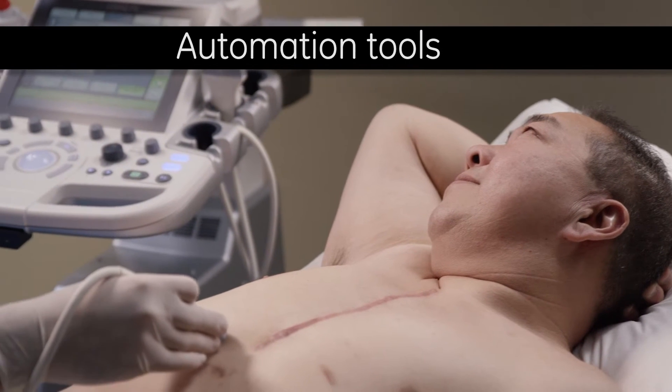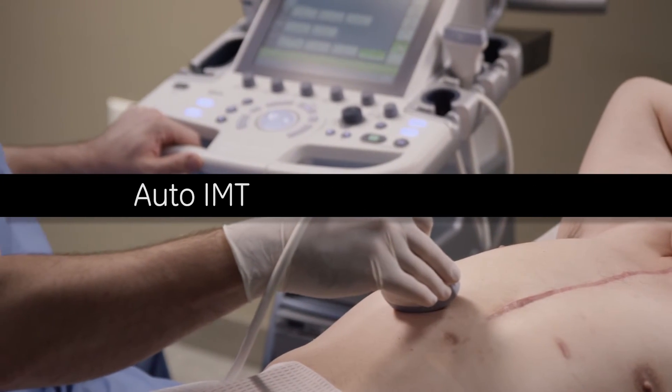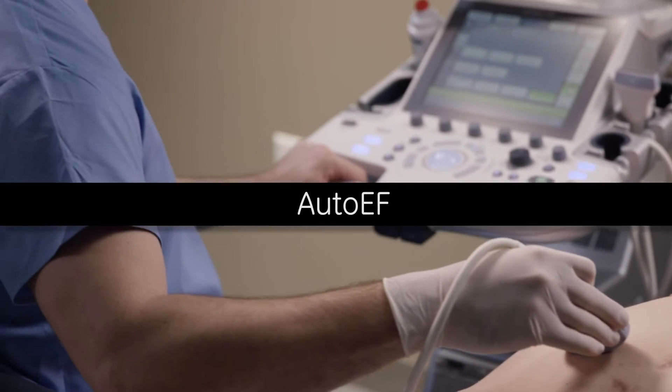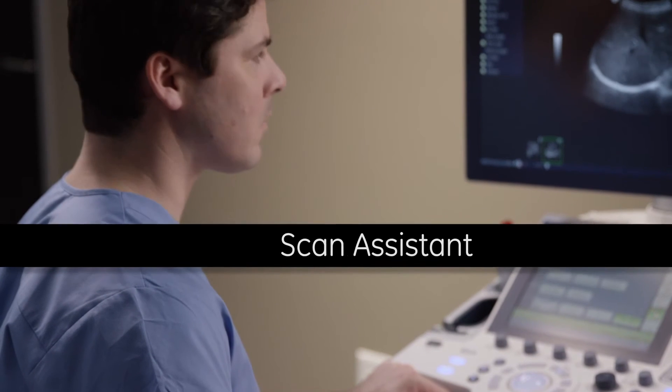Automation tools help provide fast exams, including automatic imaging optimization, auto IMT, auto EF, measure assistant, compare assistant, and scan assistant.